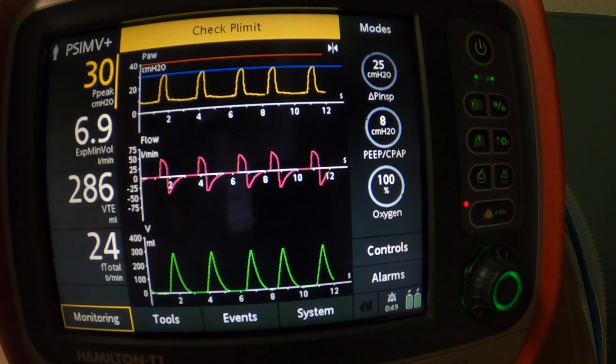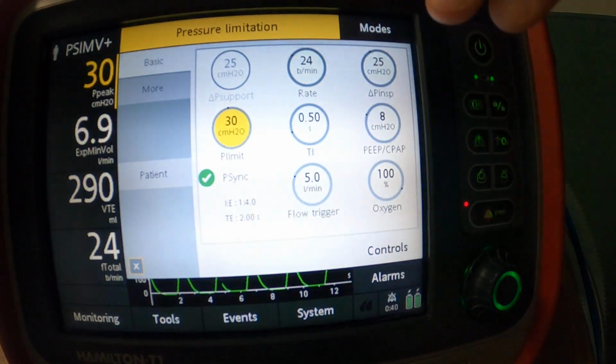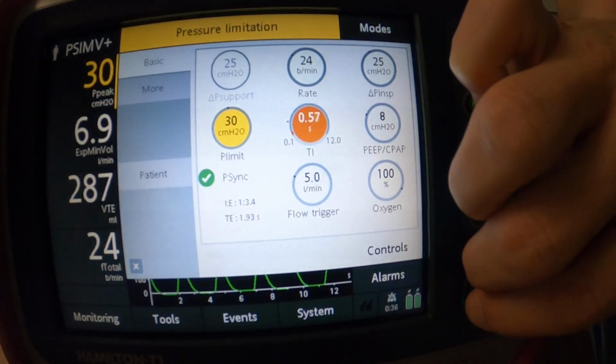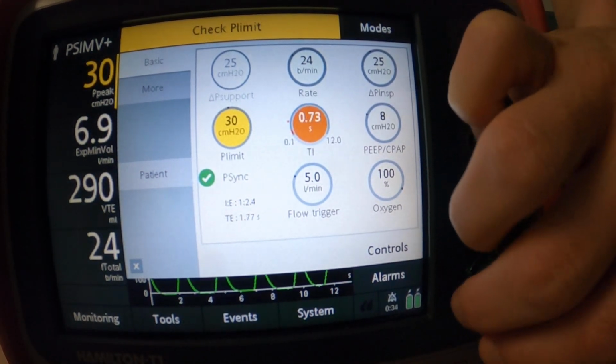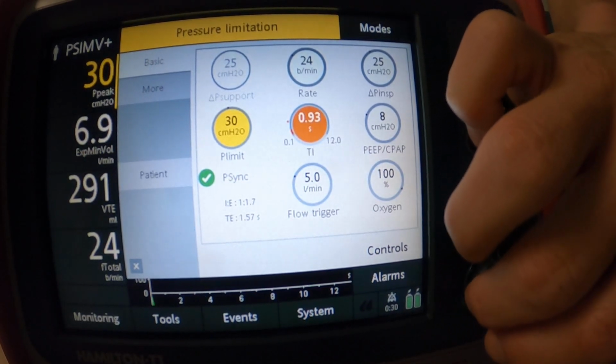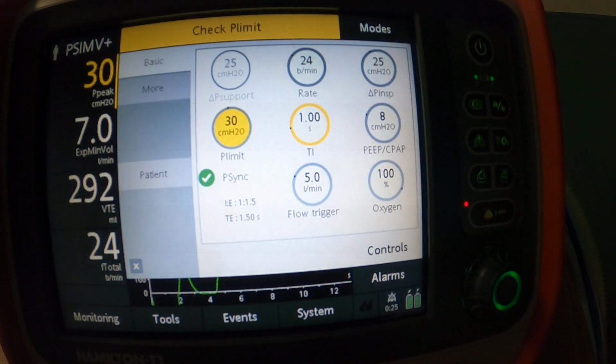So what are some other techniques that you can use in these patients? Well, on the ventilator alone, we can adjust our I time. By increasing our I time, it slows down the rate at which we're squeezing our bag valve ventilator. Go ahead and attach your bag valve ventilator to an ET tube. Squeeze it over a second. It doesn't generate so much pressure.